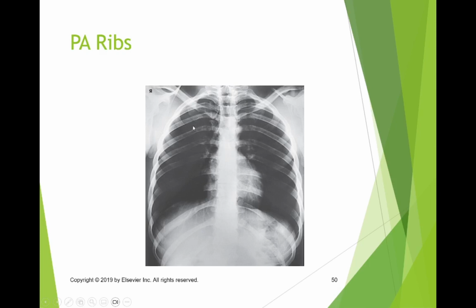But what you also might notice, or might not notice, is the lung markings. You don't see the lung markings at all on this. So we've got one of two things here. We either have a phantom, like what we use in our lab, positioning pixie, which tend to not have well-defined lung markings, or they used what I would refer to as a limited breathing technique.